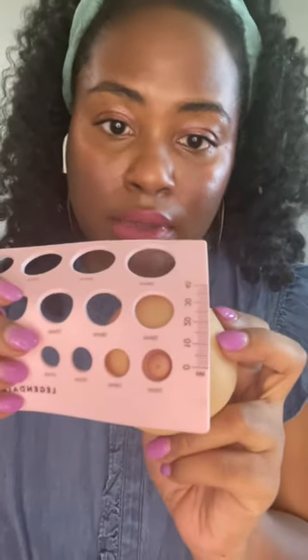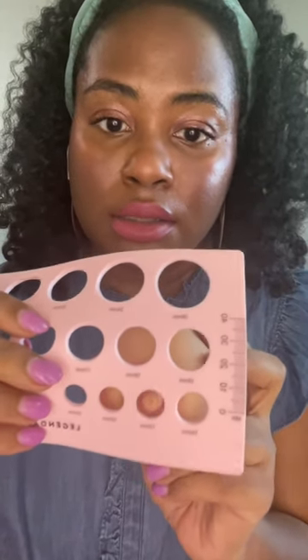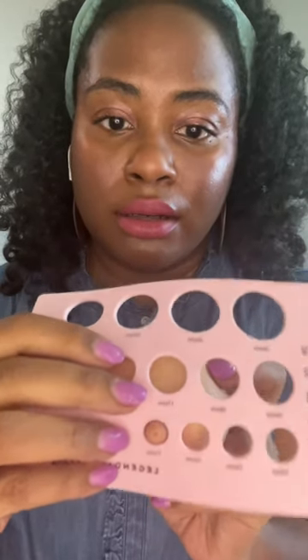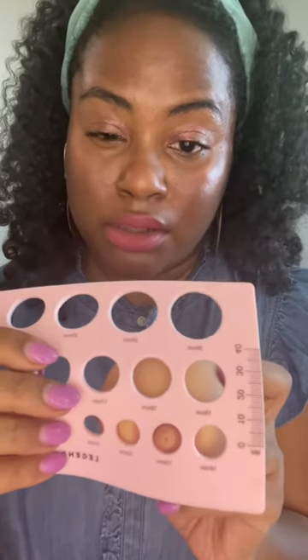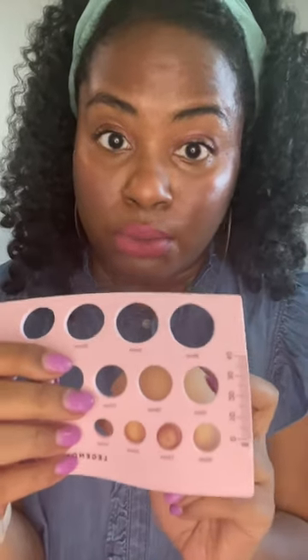We're going to start with the 14 — this is still a bit big. You want it to be able to go on and off comfortably without touching the sides. This is the 13. This is the 12. And this is the 11. The 11 is going to be too small. 12 or 13 would be my recommendation — 13 is honestly going to be too big, so the 12 might be better. In a flange consult, we would test out both the 12 and the 13 to see which one is the best size for you.